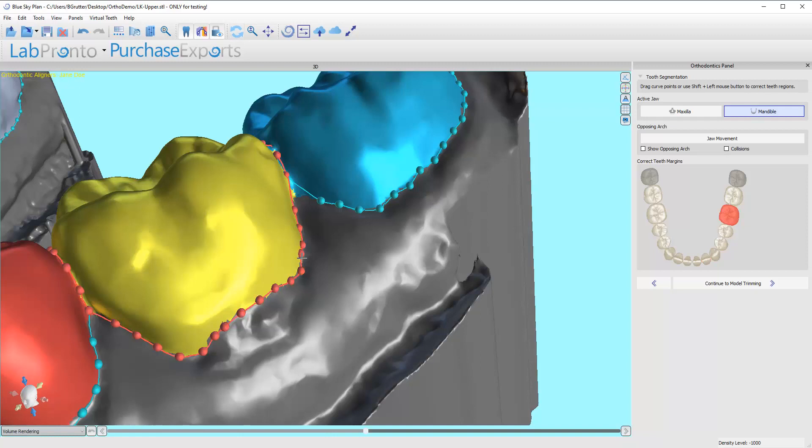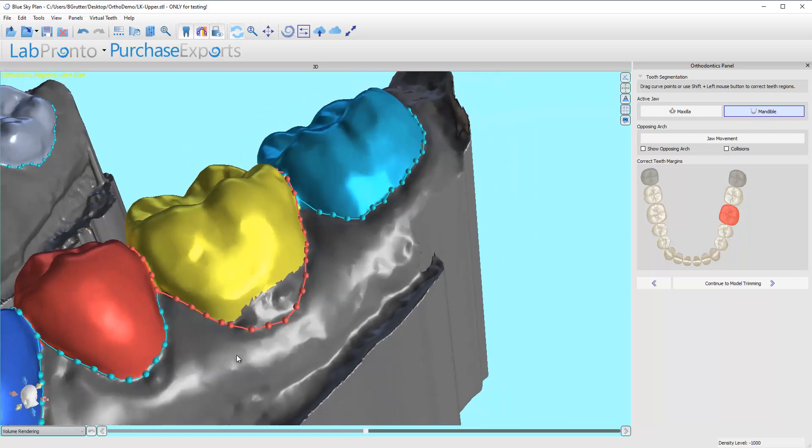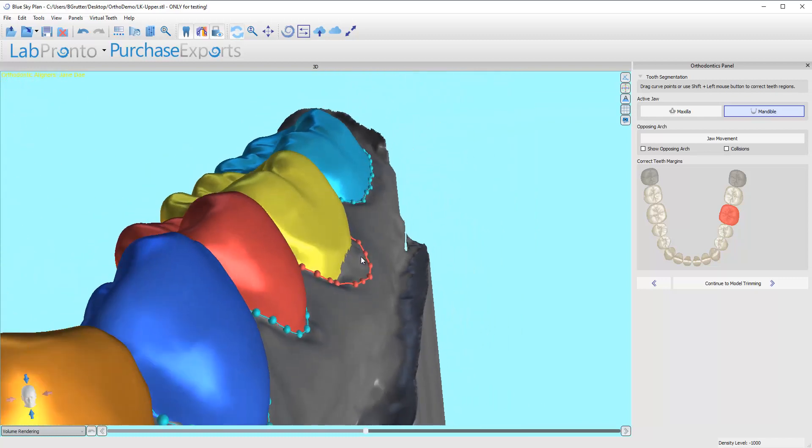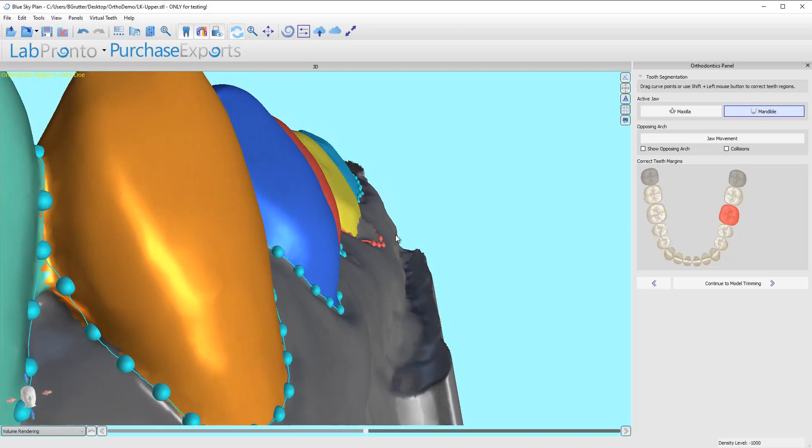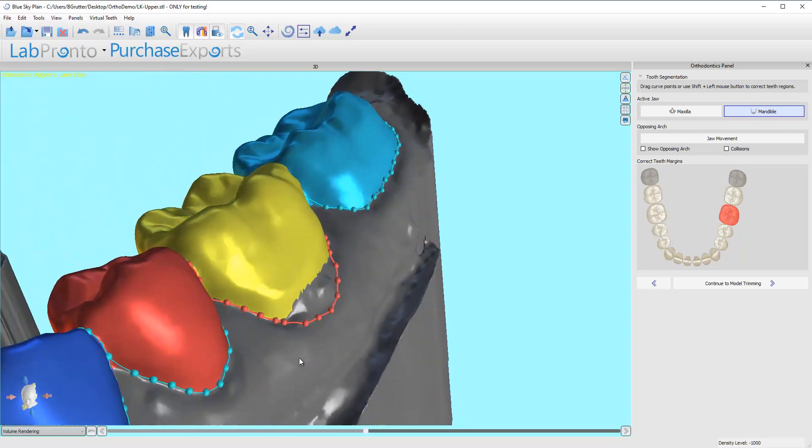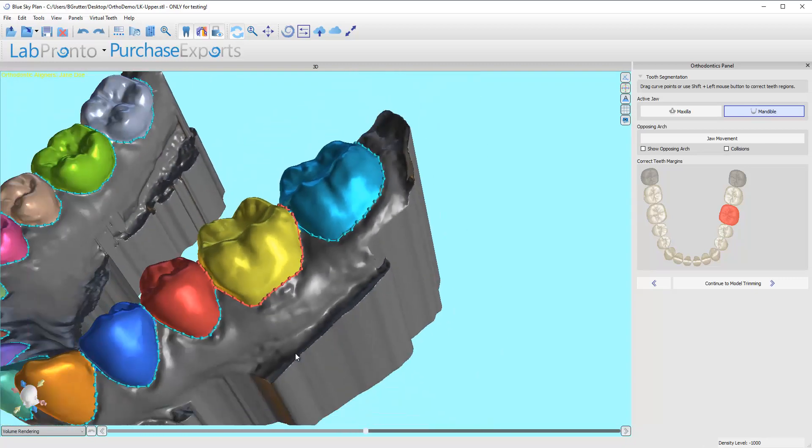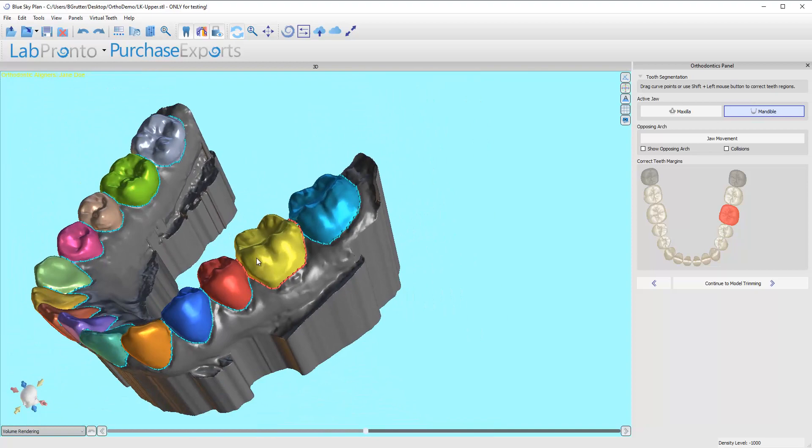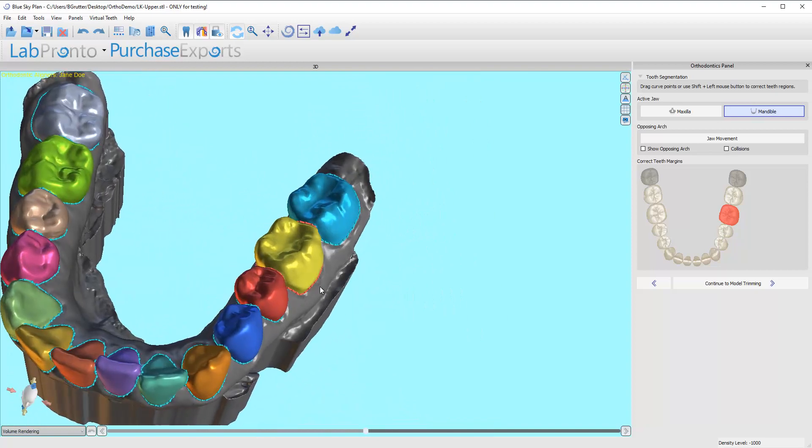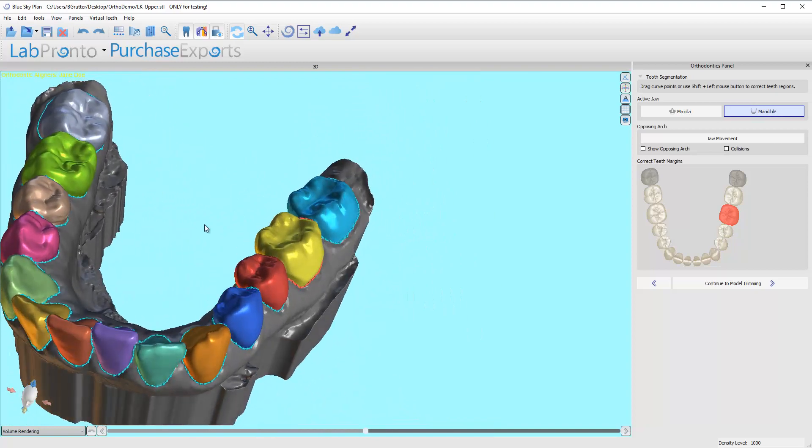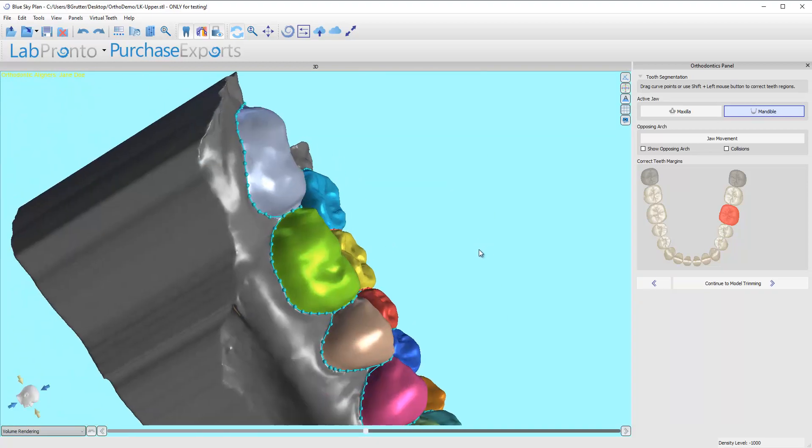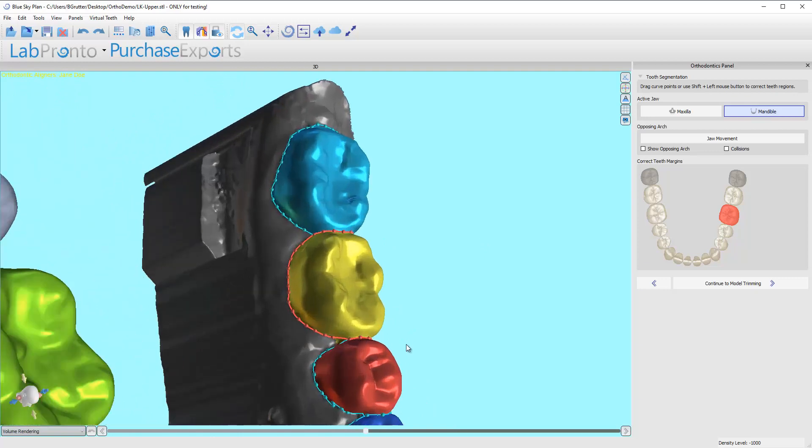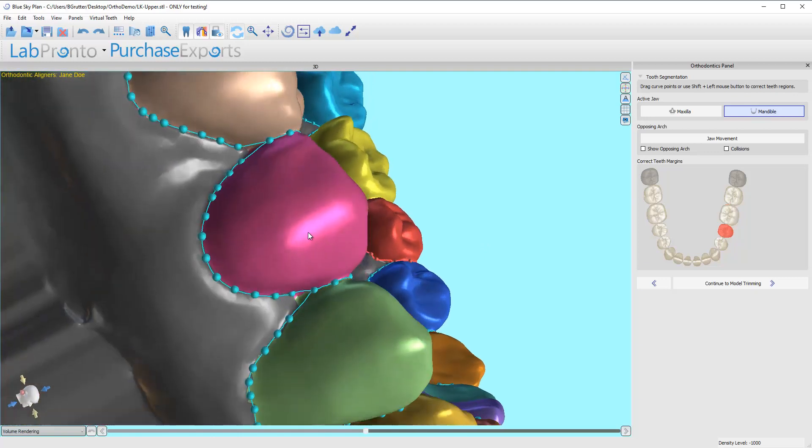As you can imagine, it's pretty obvious why the software didn't like that. And to be honest, I don't really like that. I'm just going to control Z. I'm going to leave it there. I'm going to let the software deal with that. It's still going to move that area, it's just going to treat it like gingiva. And since I don't think that's an accurate representation of the tooth surface, I'll leave it be.